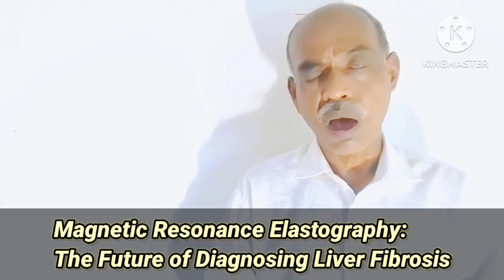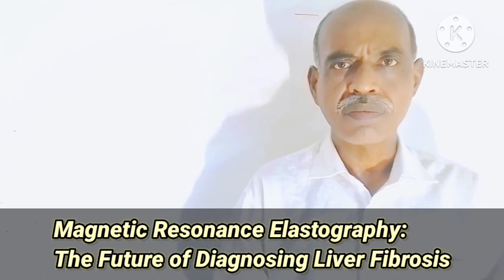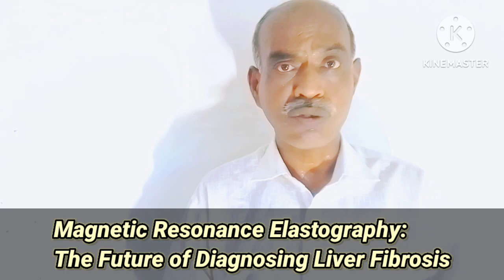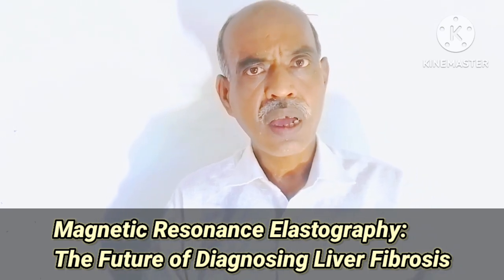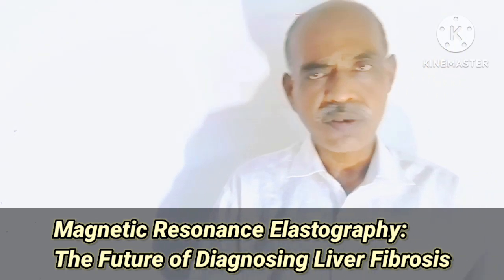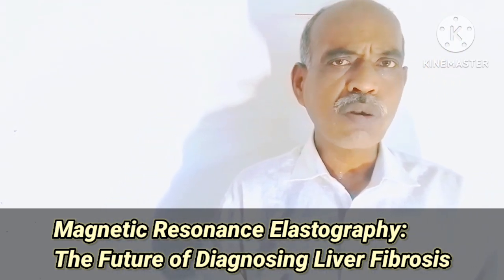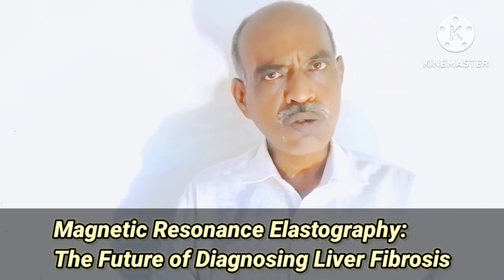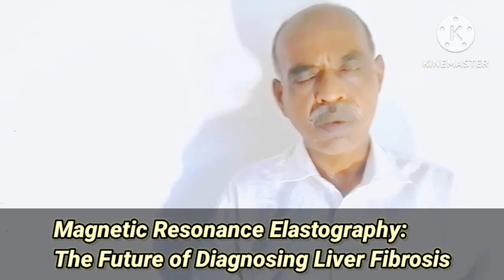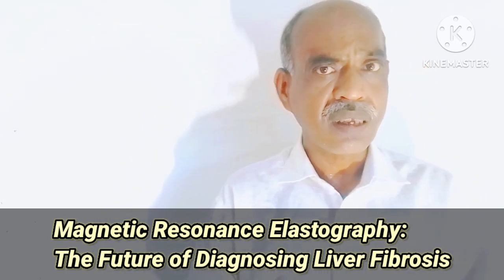Now, how does this actually work? What is the working principle behind this MRE? Actually, low frequency sound waves are used, and when those low frequency sound waves travel through our body, say we are talking about only liver here, in case of liver, soft tissues are there, again stiff tissues are there. If the patient is suffering from liver fibrosis, soft tissues as well as stiff tissues are there.